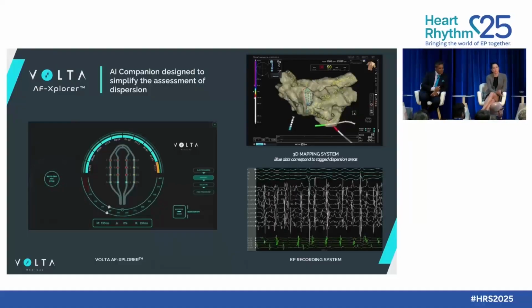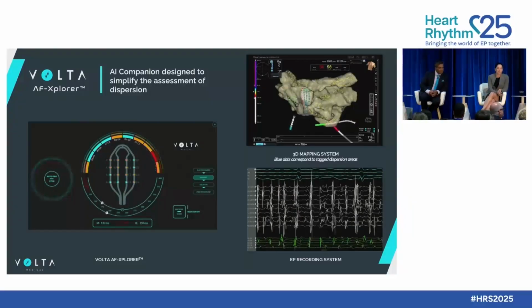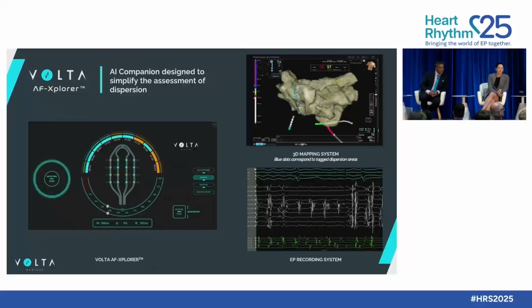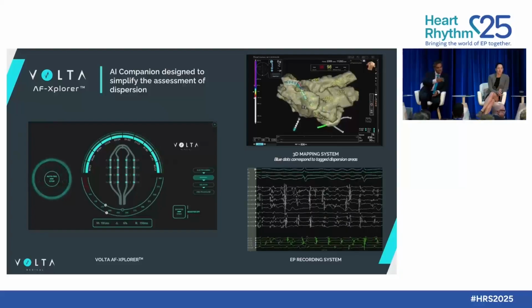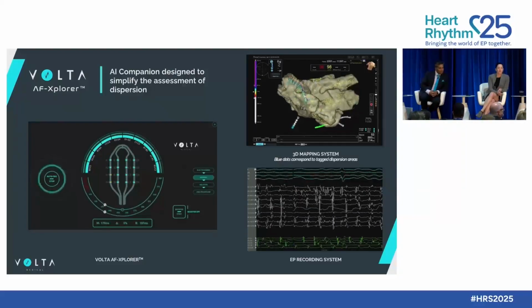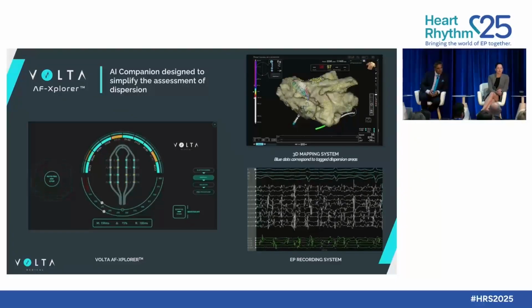This is the technology itself. You use a multi-electrode catheter here. You can see it's a grid-type catheter. As it's swept along within the chamber, you get immediate information from the catheter. It analyzes signals, and then you'll get an idea as you see those orange dots light up, and some of the electrodes lighting up, suggesting that, yes, there is something very interesting happening at this location.